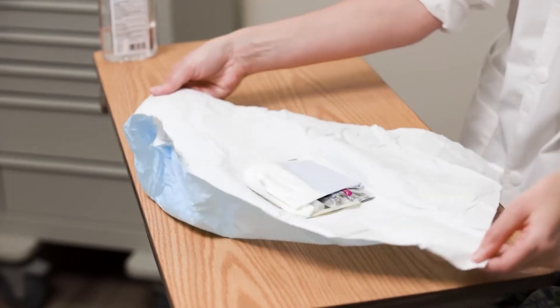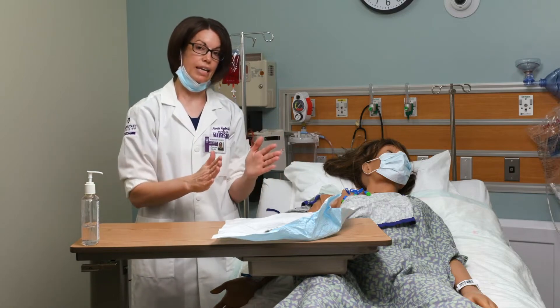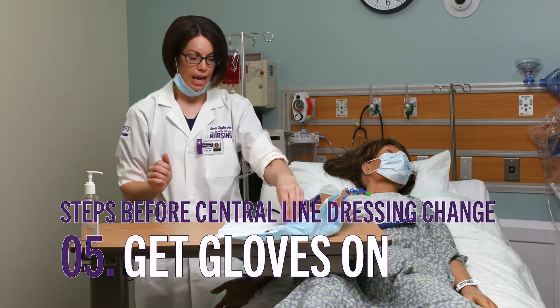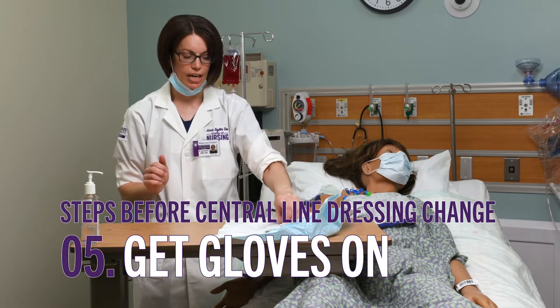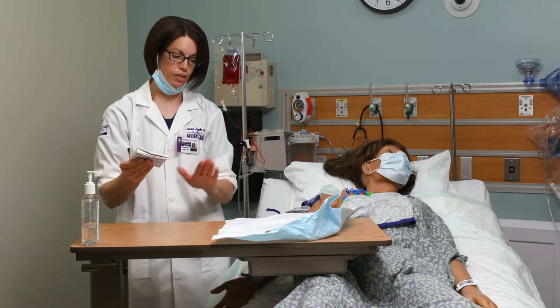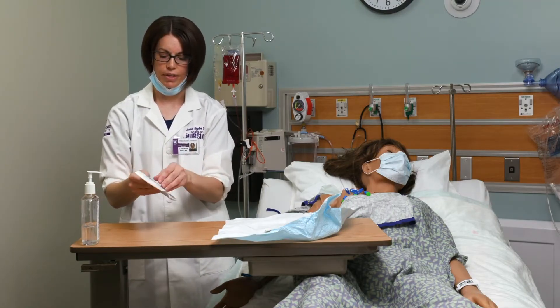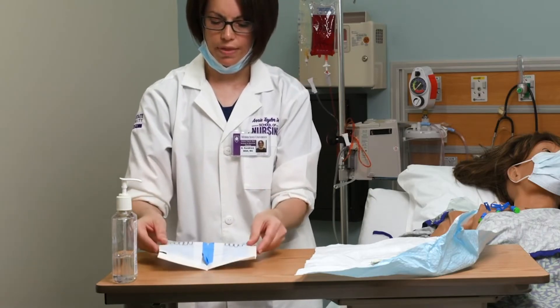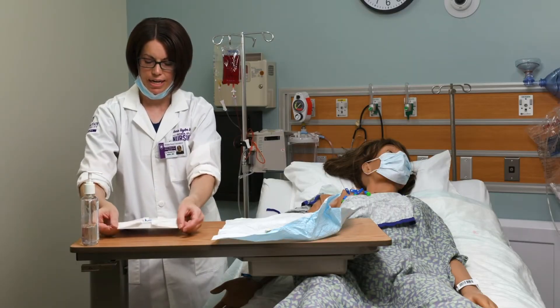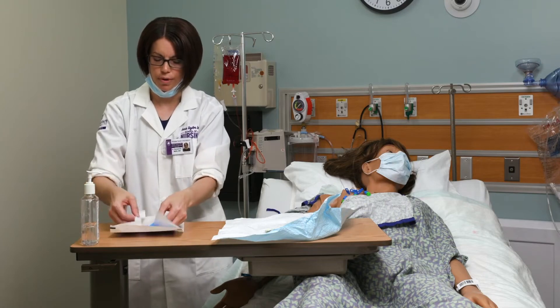I want to make sure the kit is not folding back in on itself. Next I want to take my gloves out, being very careful not to touch anything else in there. I'm placing them right to the side of my sterile field, being careful not to touch anything in my sterile field until I've got my gloves on. I'm going to open the gloves — there's a little paper that folds down, and you can push it up to help keep the package open.